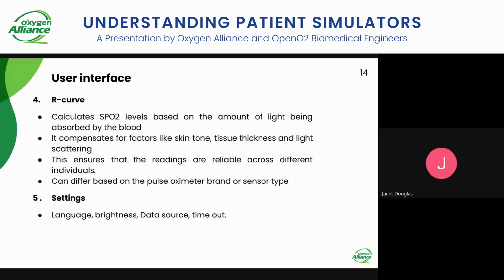Those 5 factors should help you determine what kind of simulator, or which brand or model, you should go with, based on the needs of your facility or your needs as an engineer when it comes to monitoring or assessing the performance of the patient monitoring devices that you have. So we don't support any brands. Any brand is okay based on the needs that you have. Thank you.